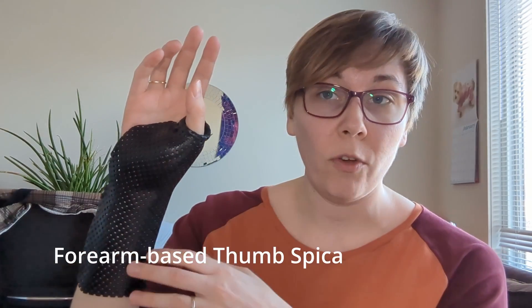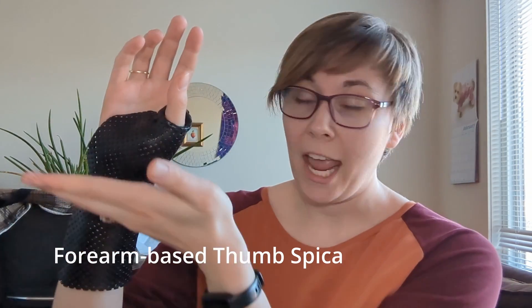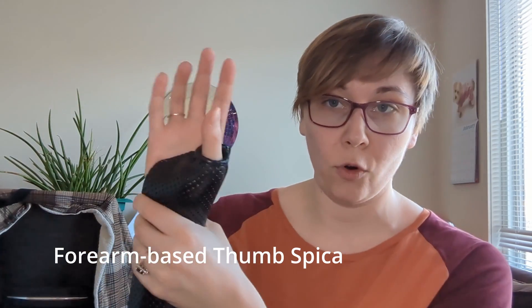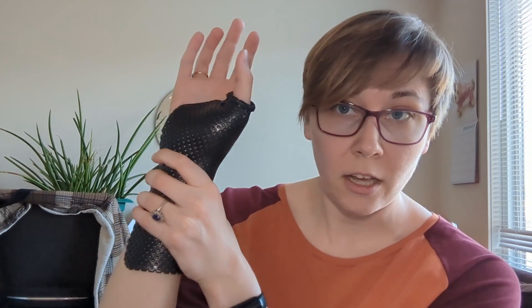Conservative management of this condition involves rest to allow irritation and inflammation to come down. Because of its placement in the wrist, and because it's involving tendons that move the thumb, we want a brace that is going to immobilize the wrist and the thumb. That may look something like this — a forearm-based thumb spica. A thumb spica is a splint that provides support to the thumb. Forearm-based crosses the wrist and includes the forearm, so it immobilizes the wrist as well. This is a custom thermoplastic hard brace, though you could also use a soft over-the-counter brace.